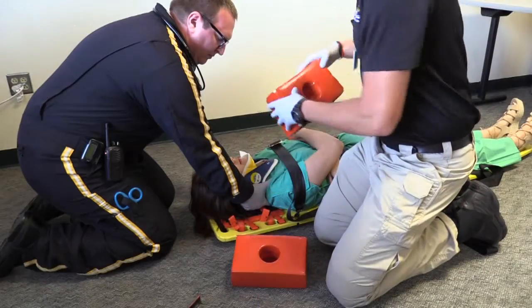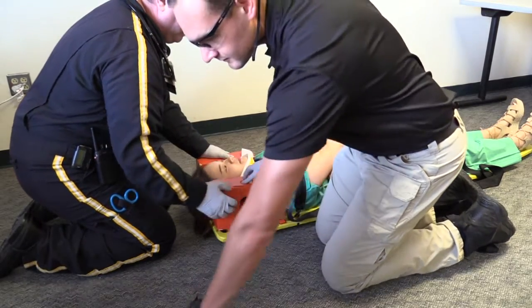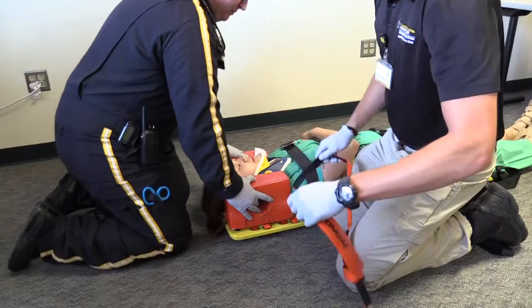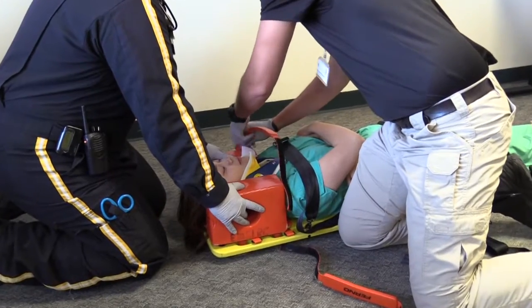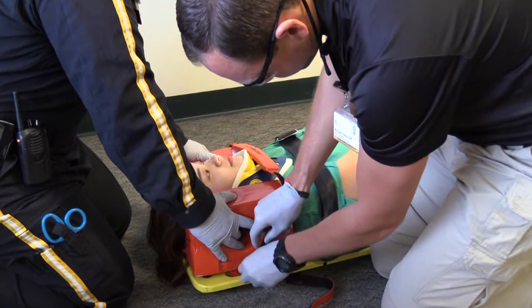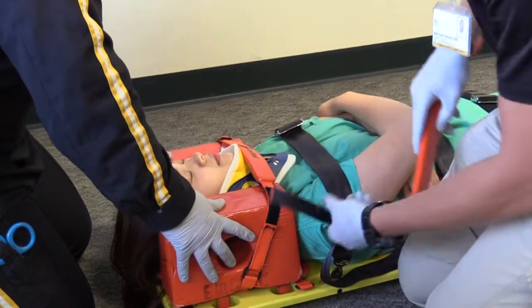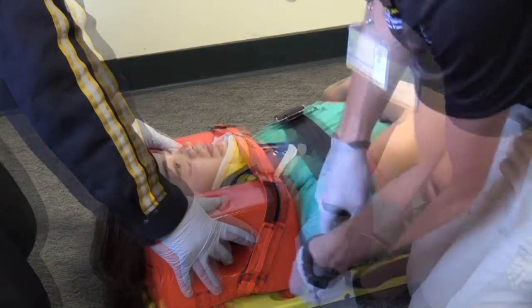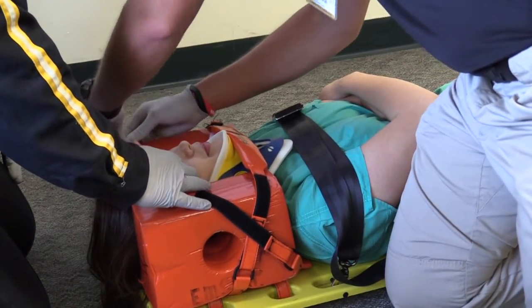The last region to be secured is the head. Following securing the head, the person holding manual stabilization can let go. If the patient cannot cross their arms over their chest, I may need to secure their upper extremities.